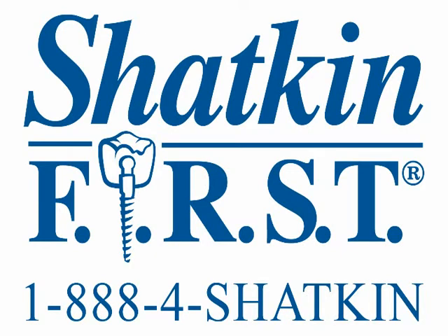Todd, what are the types of treatments that we can place on these mini dental implants? Well, they started out back, like I said, in 1999 being used primarily for lower denture stabilization, and I started doing a lot of lower denture stabilizations the first year, and I started realizing that we were having such good success with the lower denture that I wanted to try it on an upper denture. So we started experimenting using the minis in the upper jaw, and usually we put 4 in the lower, and I usually put 6 in the upper.